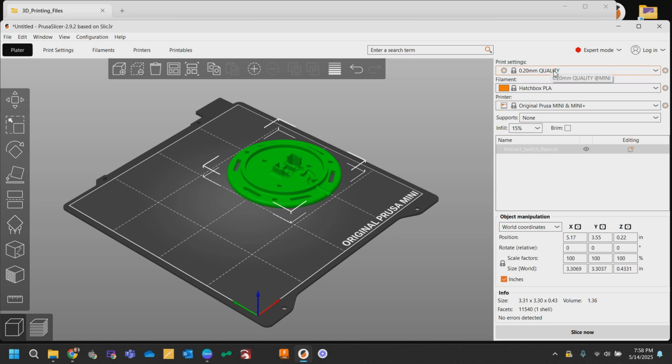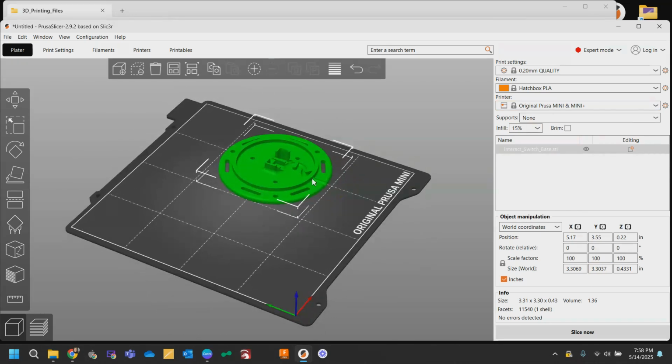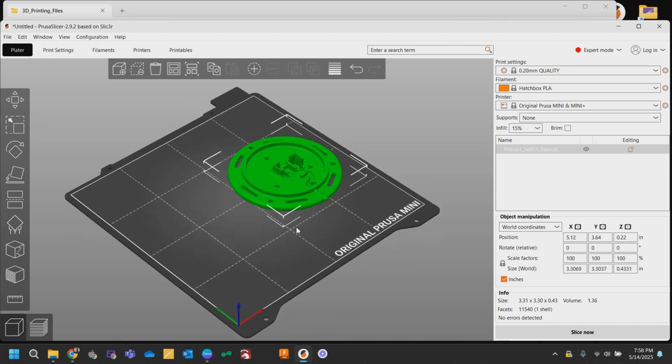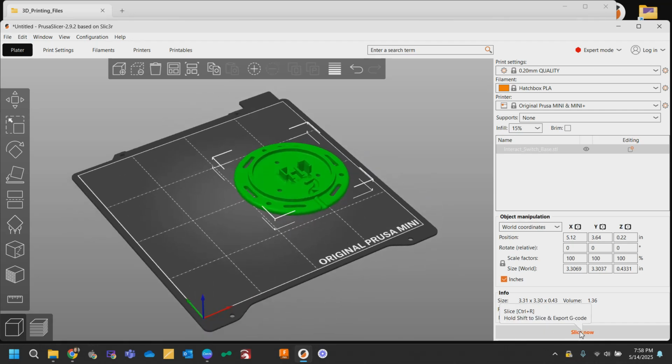You can pick the quality of the print, how fast and slow it's going to go. You can tell it what kind of plastic you're going to be using, which specific printer you're going to be using. There's a number of parameters you can set. You can move it around on the build plate and choose your position. And then you're going to click slice when you've got all your parameters set.